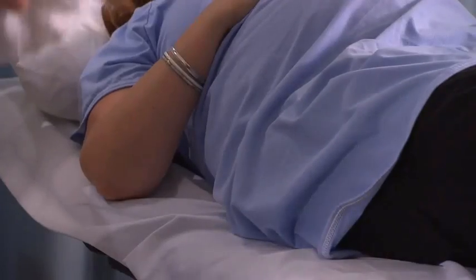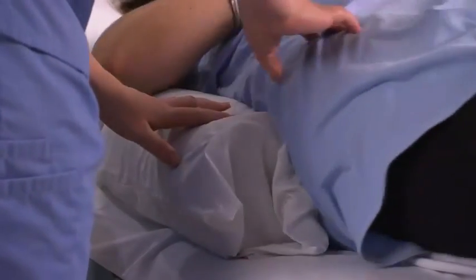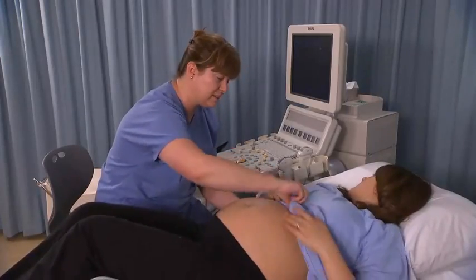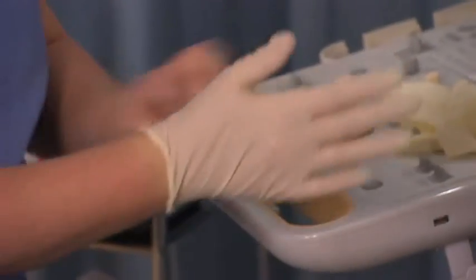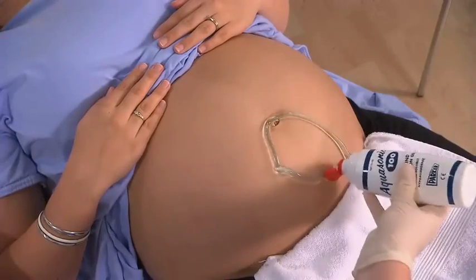It may be necessary to use a pillow to prevent compression of the vena cava, which could otherwise cause fainting. For a transabdominal scan, expose the lower abdomen and apply gel in the midline, from the symphysis pubis up to the umbilicus.